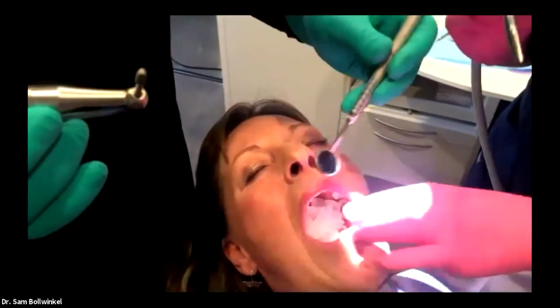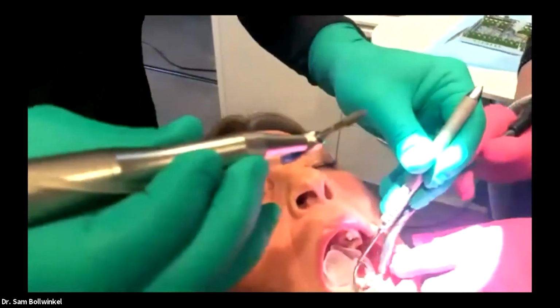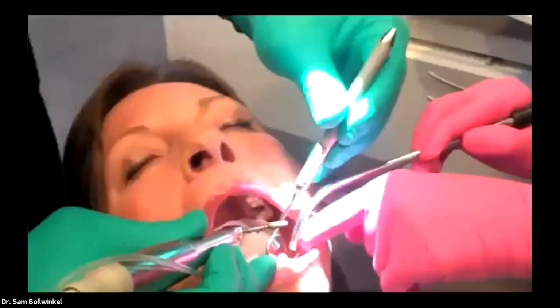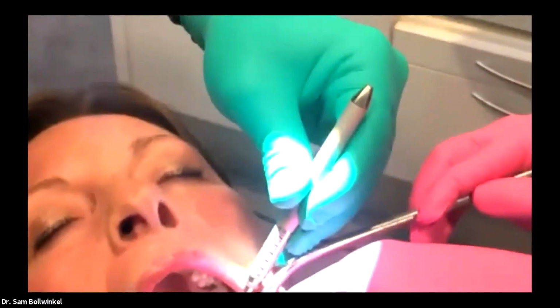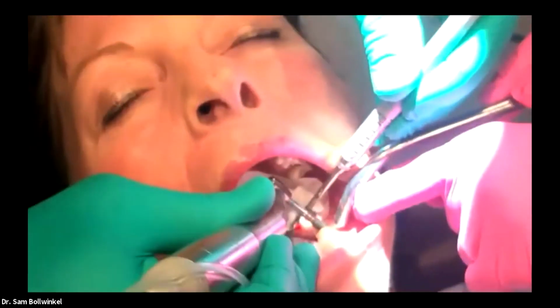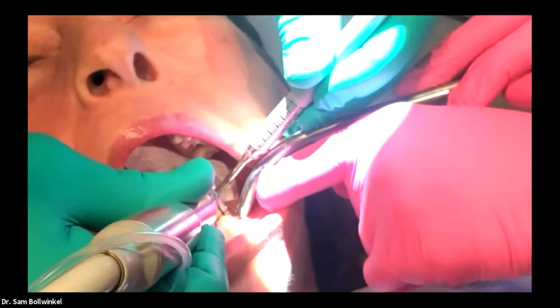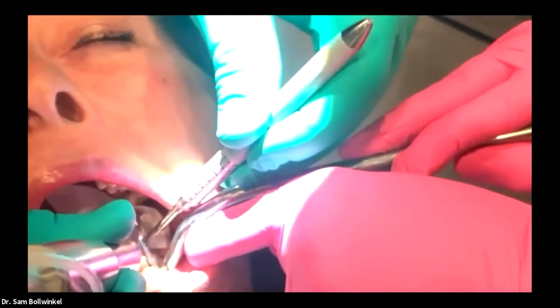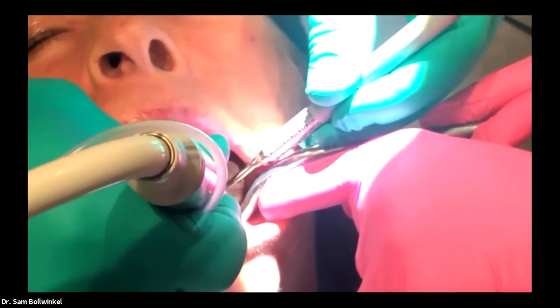All right, good. Hold on, a little suction there for you. Good. All right. How's our lighting there, cameraman? Okay. So implant's ready to go. I'm going to make sure it's turning. We're going to go in for placement. A little bit of pressure. How are we doing, Carrie? Doing okay? Good deal.